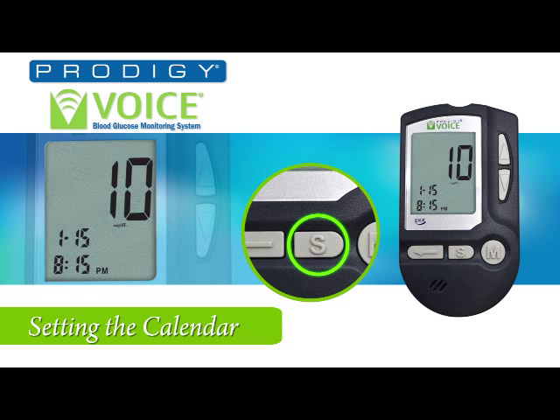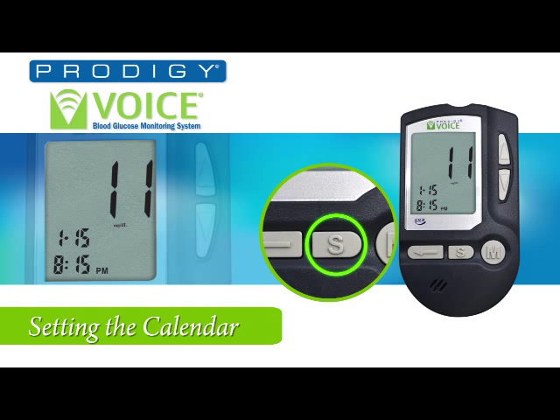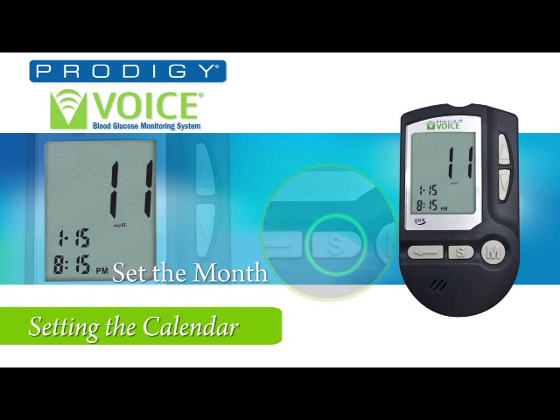Now press the set button to set the year. You will hear: 'The year 2010.' Press the up or down buttons for the desired year. Next, press the set button to set the month. You will hear: 'The month January.' Press the up or down buttons to set the desired month — February, March.